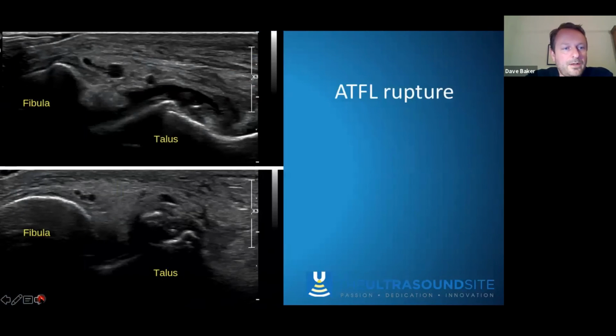So here we're looking at a ruptured anterior talofibular ligament, and here we can see evidence of some effusion. Also, we see some of the debris, the stub of the ligament that was intact. We can also see how the surrounding connective tissue is no longer being held up and away, so you're losing the normal margins and the normal compartmentalization of the tissue around that particular area.